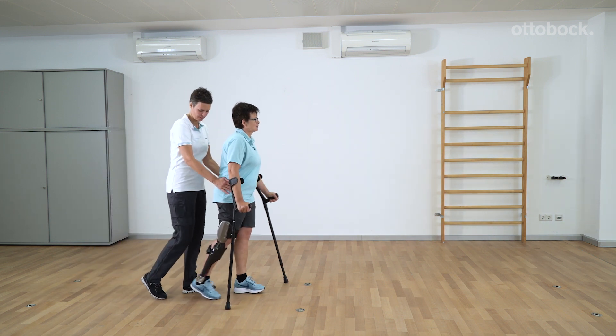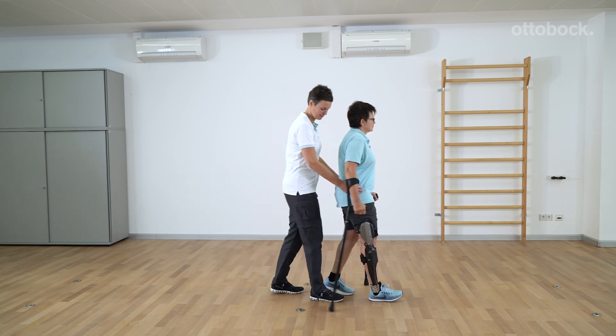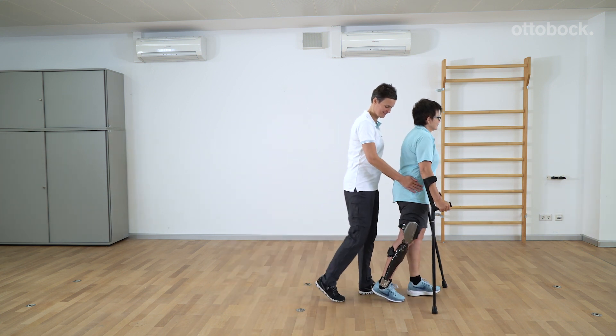First, practice the four-point gait. The patient walks with forearm crutches and the physiotherapist provides support where necessary.